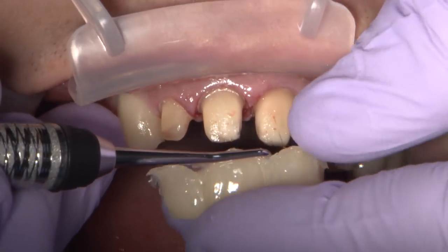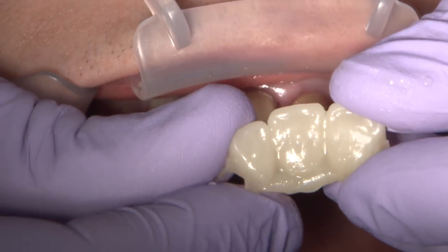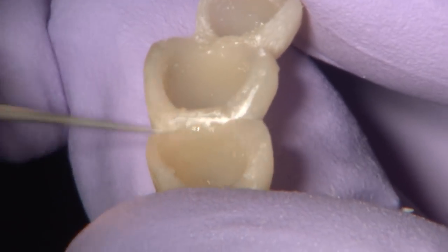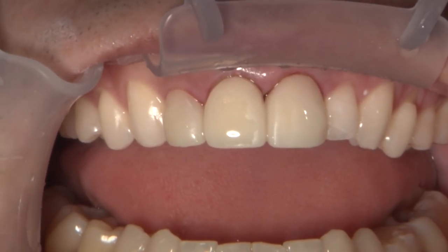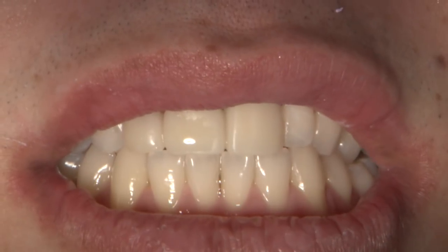Upon removal, it is apparent that the reline is a success, and the excess to trim is very minimal. I open the embrasures of splinted temporaries with a long, thin diamond flame burr to allow the recently retracted tissue a chance to rebound properly. Minimal touch-up has to be done to the facial of the BioTemp, and it can be seeded just as straightforward as the reline process.